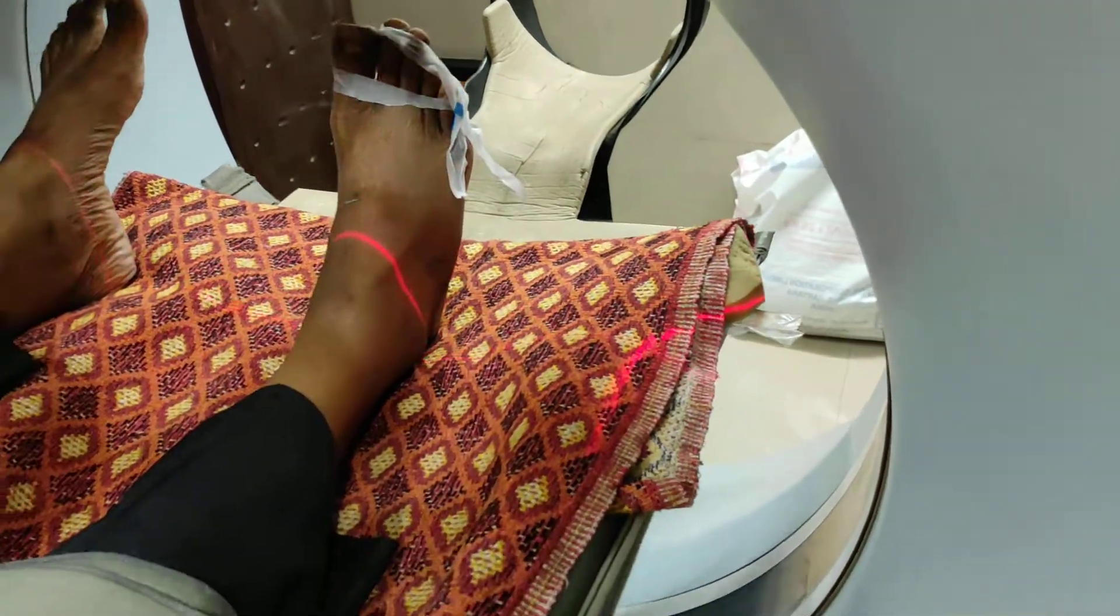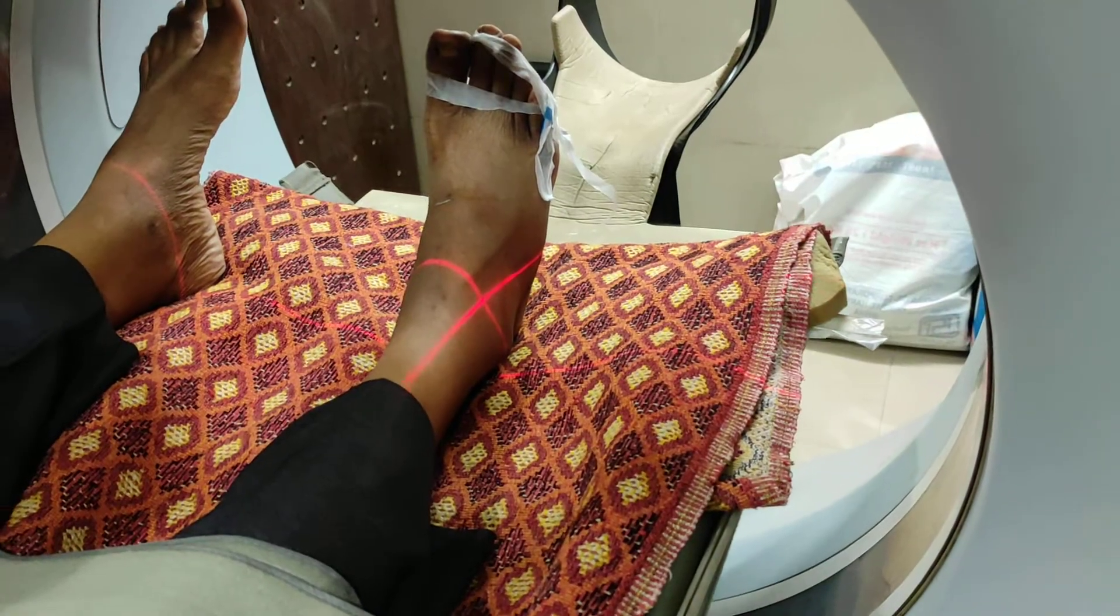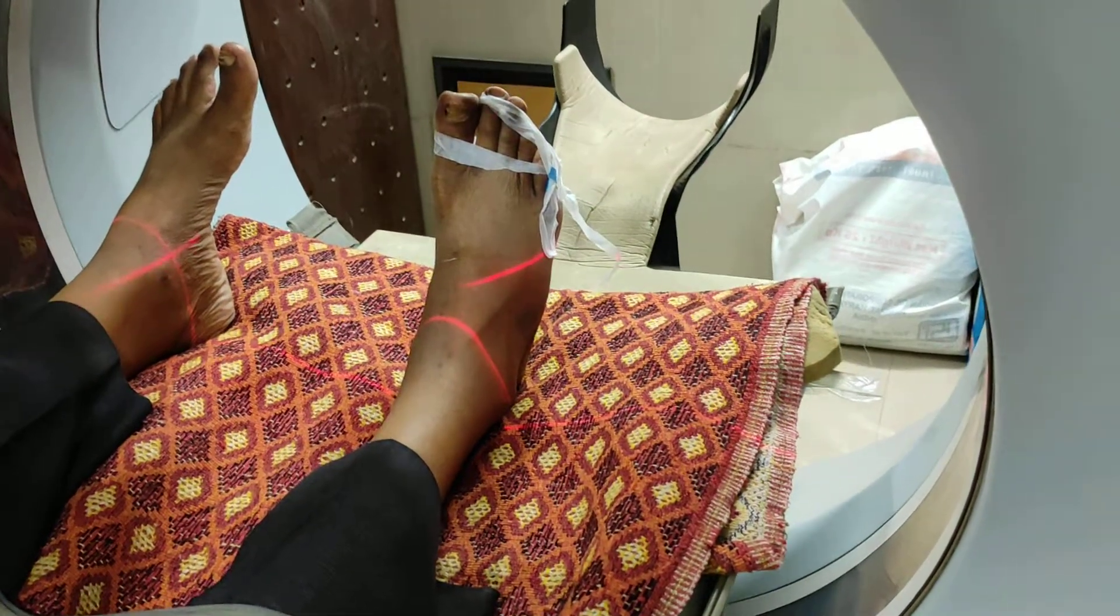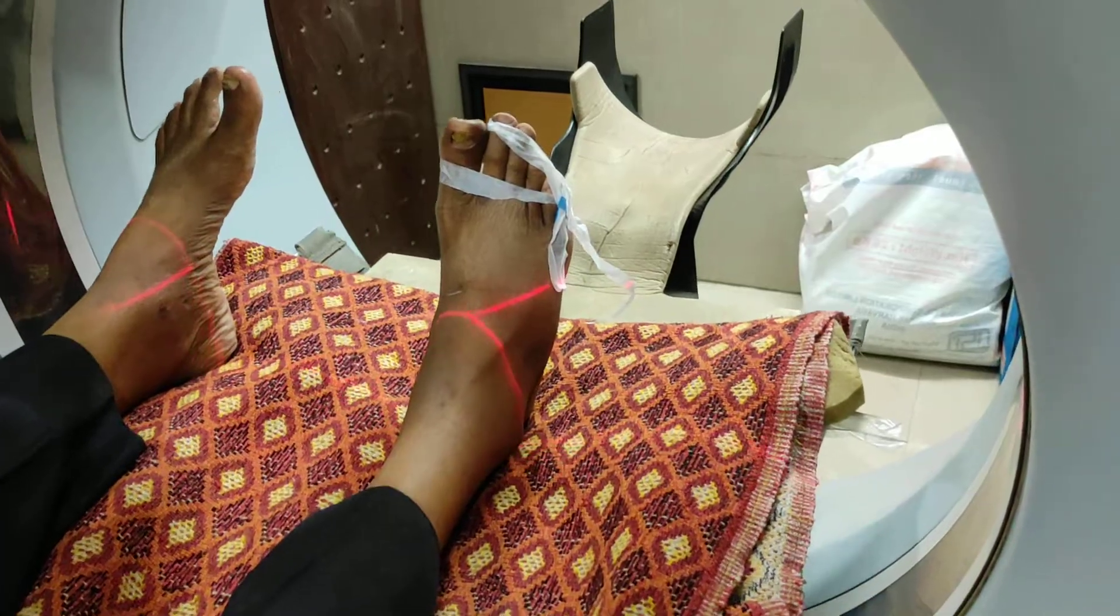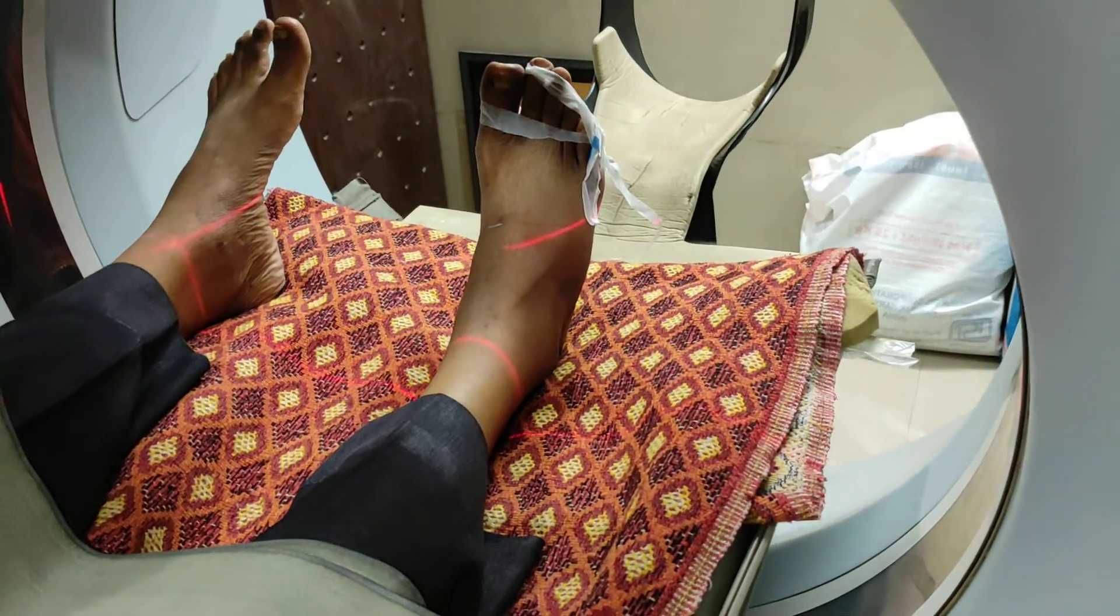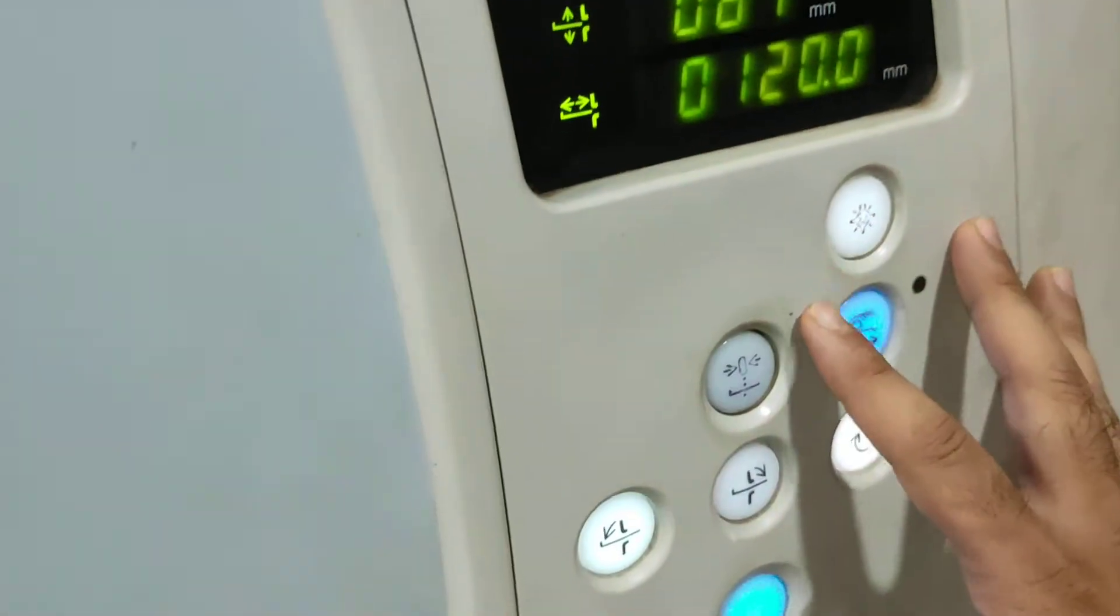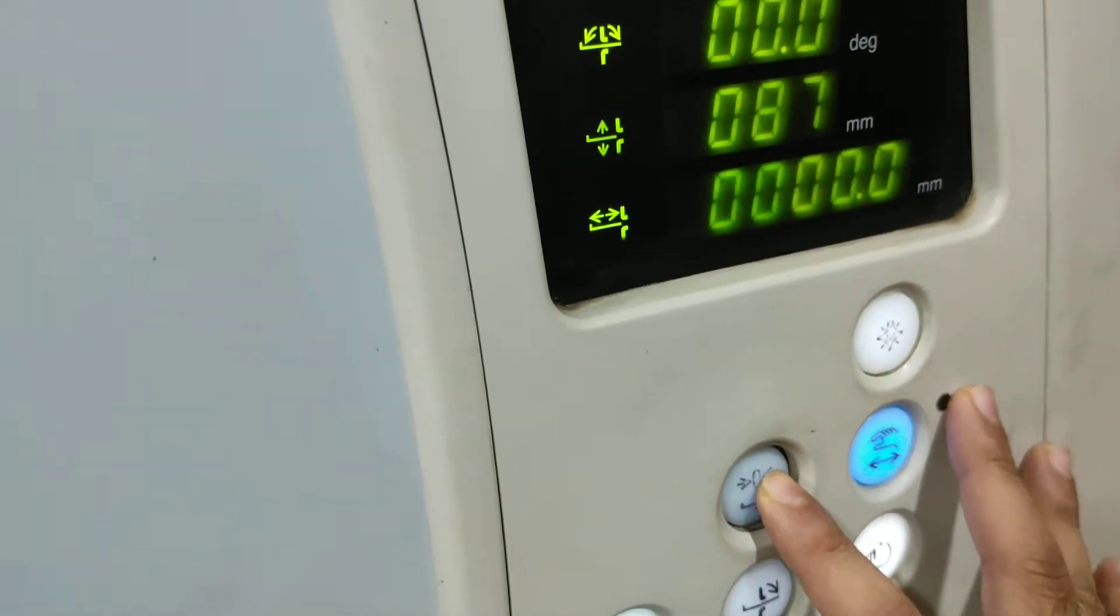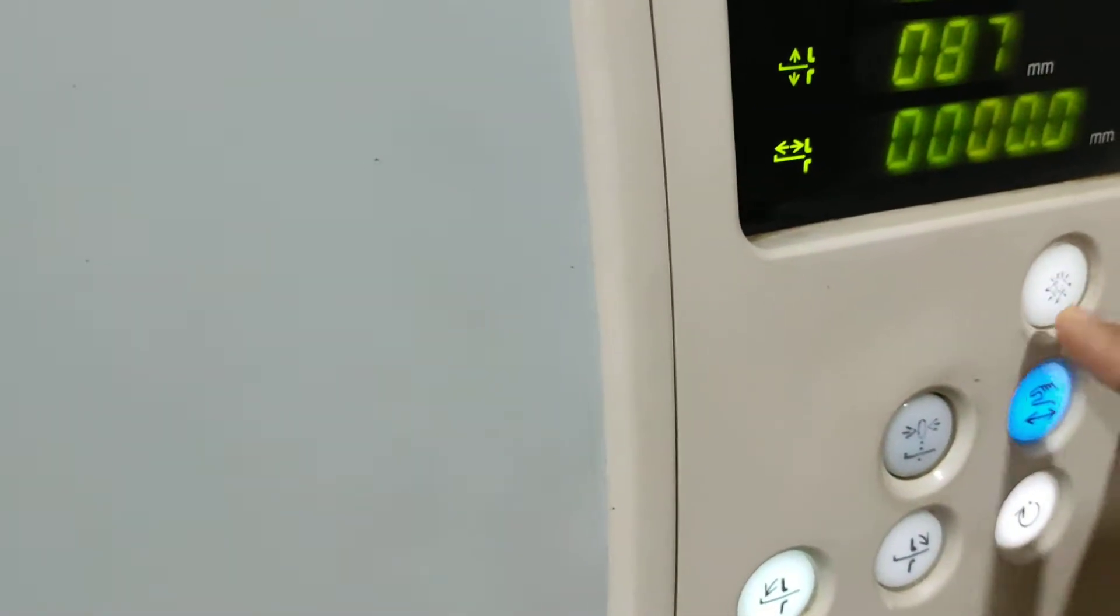You have to do centering up to the lower end of tibia and fibula. Now zero over here. Close the light.